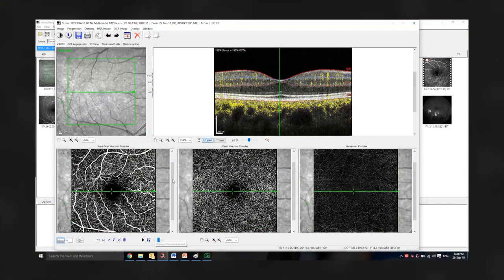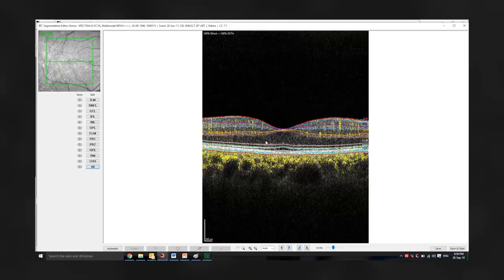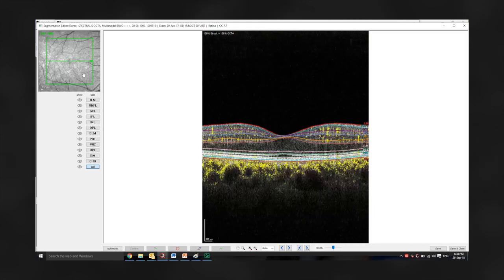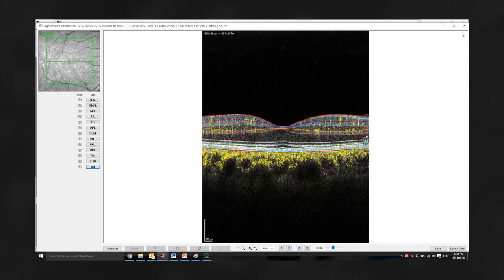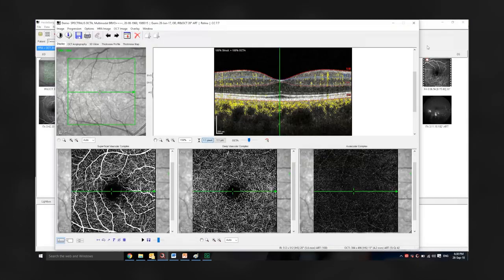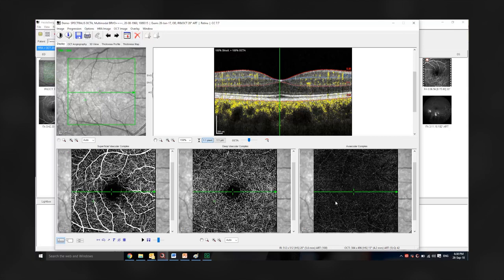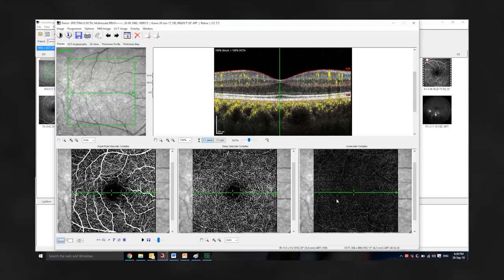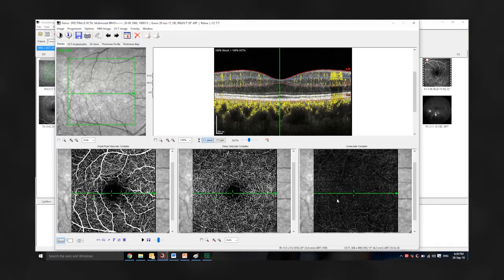When reviewing the OCTA image, we should look at the fundus reflectance image to identify any cause for poor quality data. Assess the B-scan image for accuracy of segmentation. And review the enface OCTA images or transverse section OCTA images to ensure that we're seeing accurate segmentation of the superficial vascular plexus, deep vascular complex, and avascular complex.